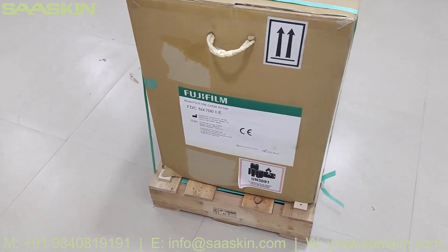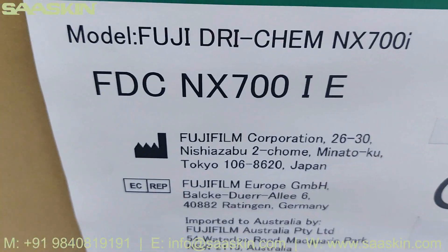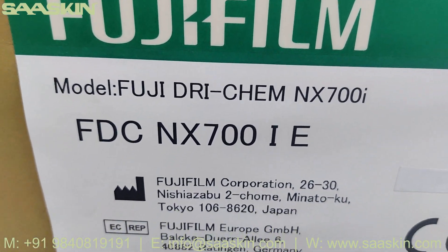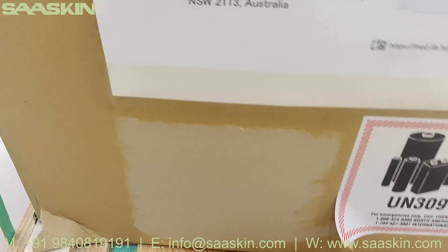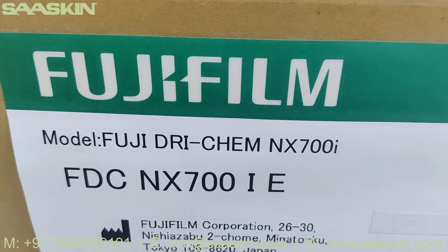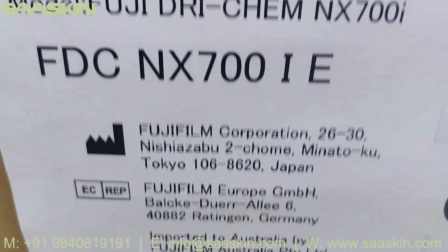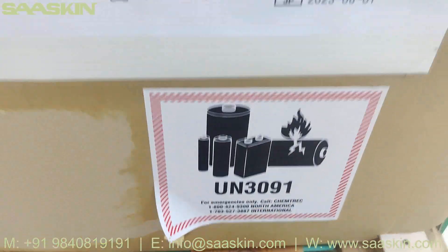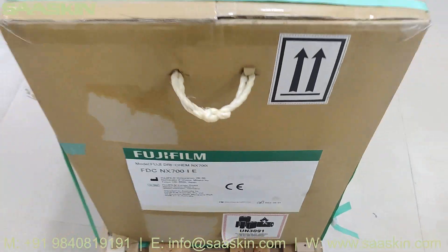Hello everybody, today we are going to see the unboxing of the Fujifilm Dry Chem NX700i Dry Chemistry Model. This is manufactured in Japan. You can see the Fujifilm model Fuji Dry Chem NX700i. This is a CE certified product.